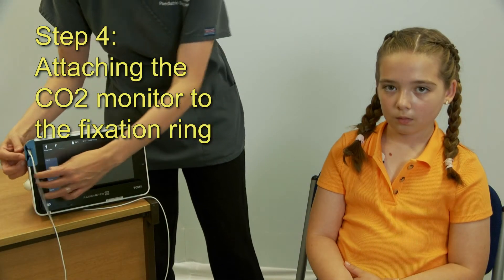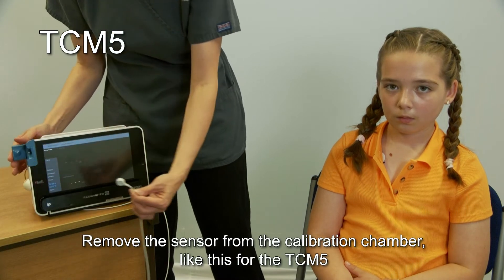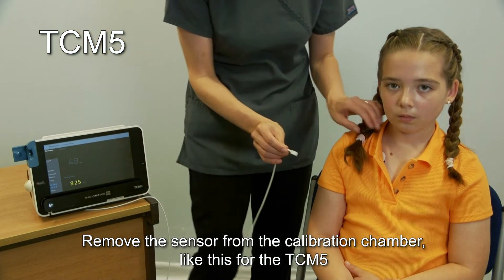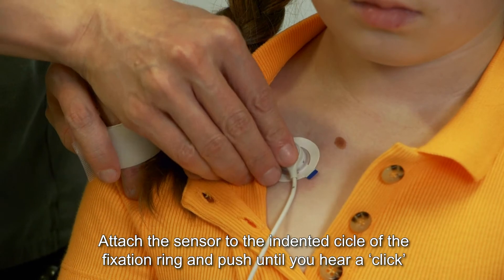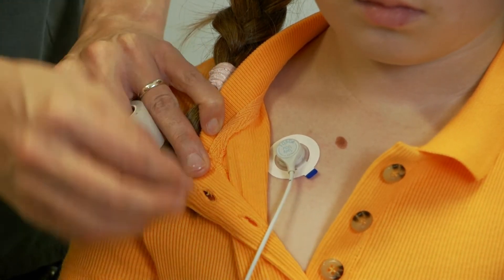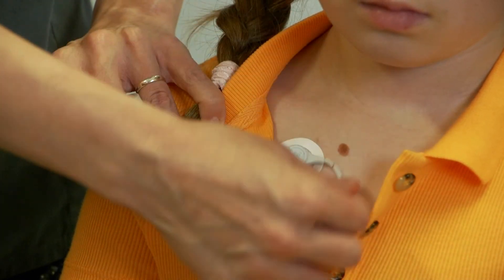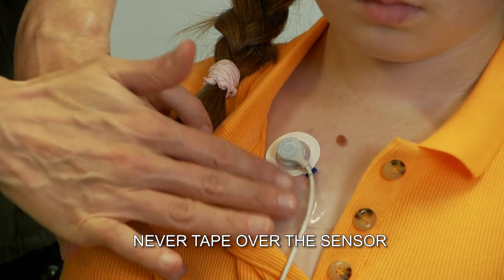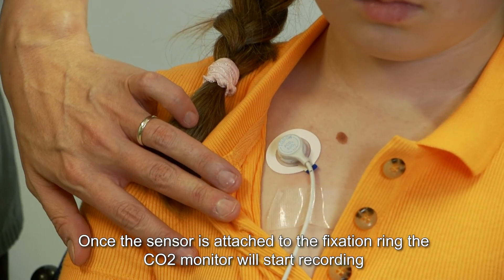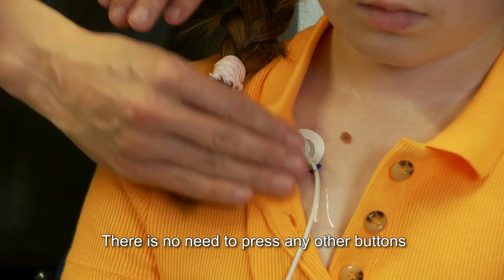Step 4: Attaching the CO2 monitor to the fixation ring. Remove the sensor from the calibration chamber — like this for the TCM5. Attach the sensor to the indented circle of the fixation ring and push until you hear a click. The sensor should now be able to rotate. You may use tape to secure the wire if you wish, but never over the top of the sensor. Once the sensor is attached to the fixation ring, the CO2 monitor will start recording. There is no need to press any other buttons.